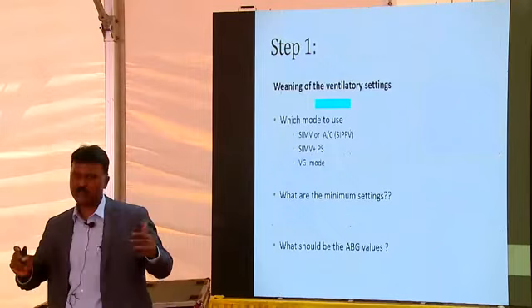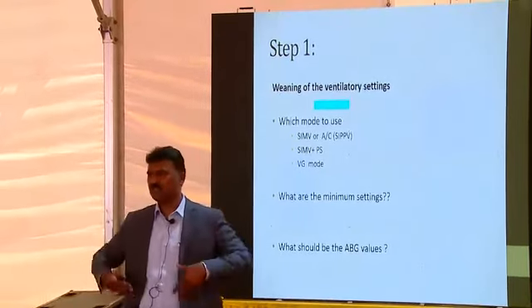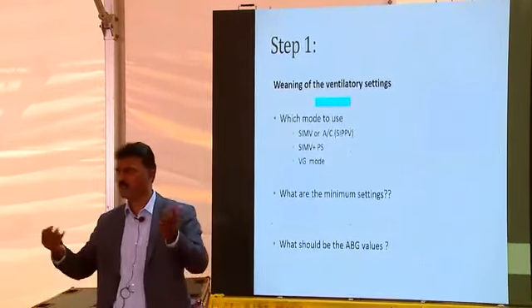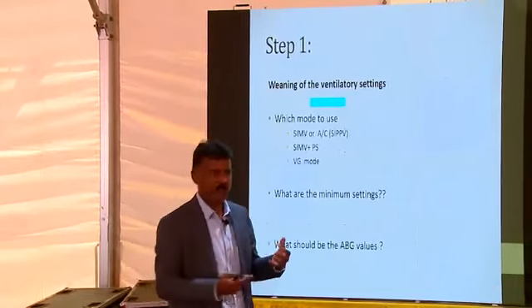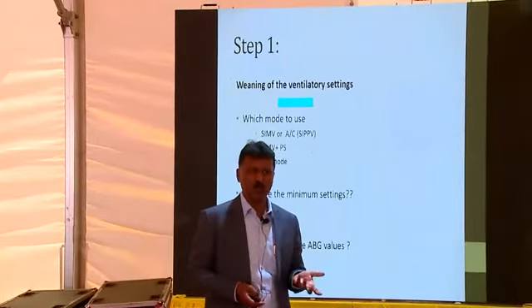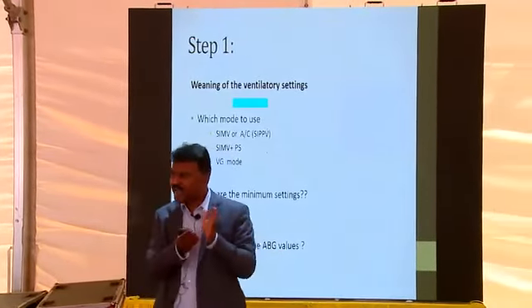Number one, because that's the commonest mode. At least we were very comfortable with SIMV. We weren't very comfortable with assist control. Maybe now I do not know if they have changed, but that was the commonest mode we were all comfortable with. So, how to wean?